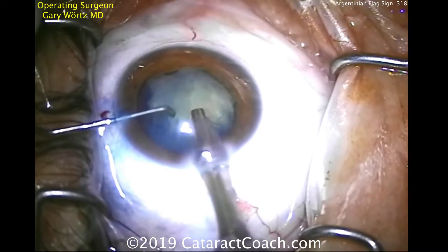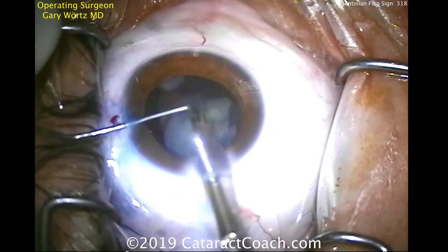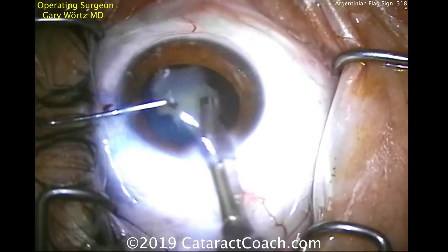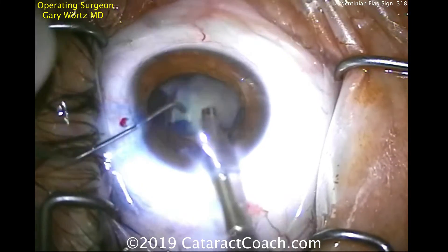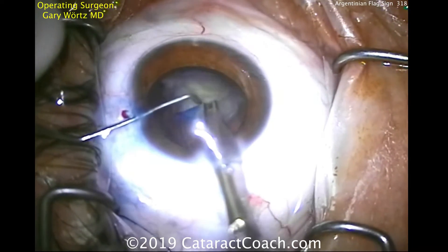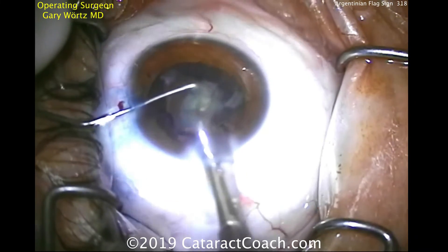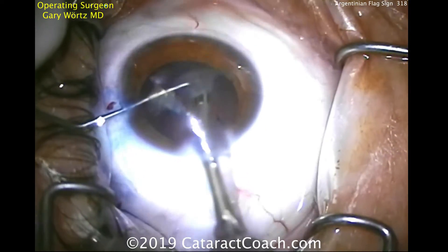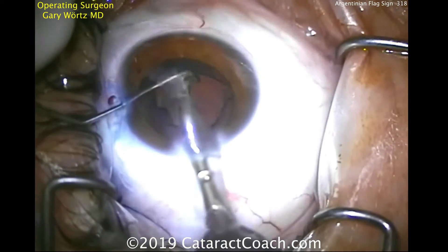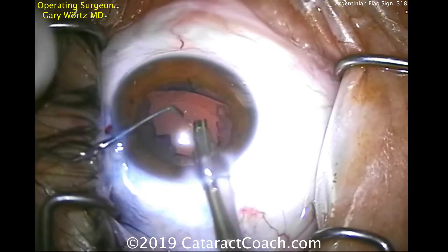Now you may ask yourself, what about these loose ends here from the can opener capsulotomy? If there are any that come in the visual axis, we can break those off intraoperatively. You can always YAG them later. But do keep in mind that prior to the advent of the capsulorexis, doing a Christmas tree or can opener capsulotomy were the standard of care — this is what was done normally. So this patient will have a beautiful outcome, and starting off with such a terrible, opaque cataract, this will be a huge improvement for the patient.